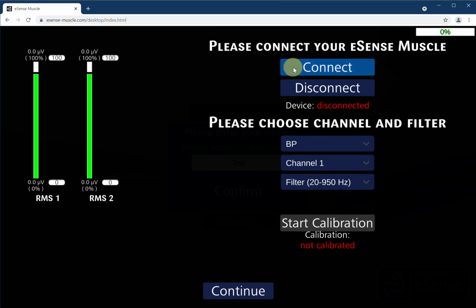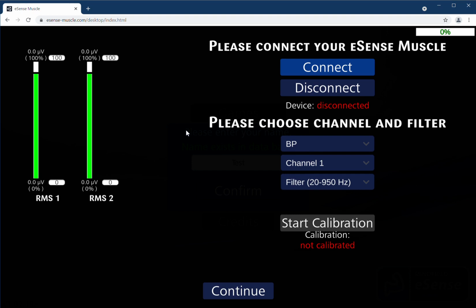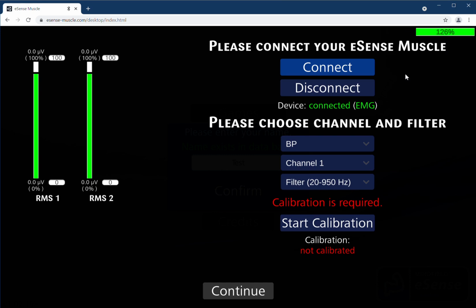I click on connect here, and you see a little pop-up saying that the eSense Muscle website wants to pair with the eSense Muscle device. I can choose here and press pair, koppeln in German, because I have a German web browser here. So after I did that, it takes a few more seconds to connect this device, and now you see it's connected here. And you also see that the battery is a little bit out of range here. We will fix that. It's showing more than 100%. But here you see normally the battery of the eSense muscle device going from 100% downwards.